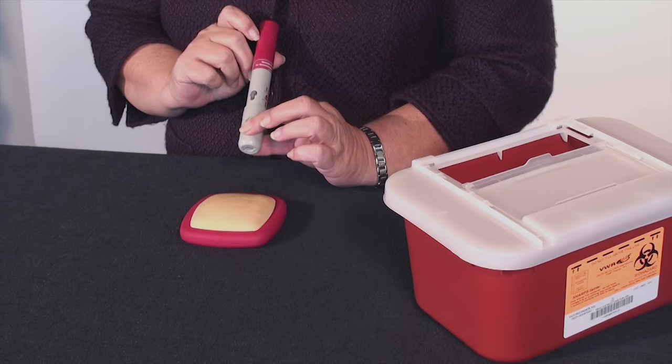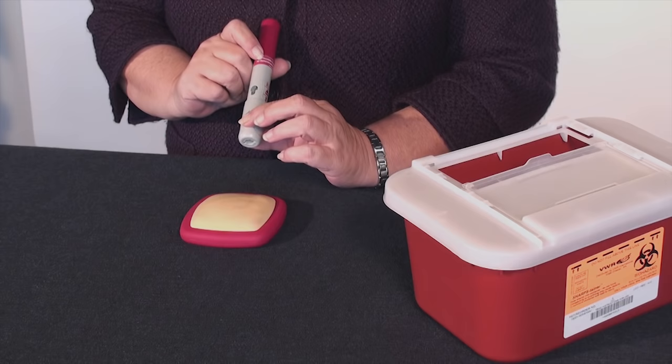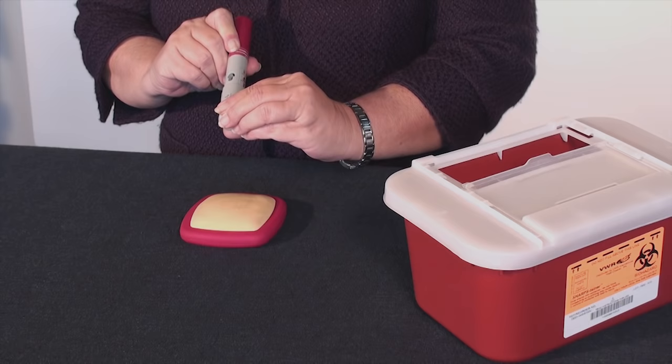Now you're going to take a look at your syringe. You have a cap number one, a cap number two, and a little window. We're going to watch this little window for a yellow indicator once we inject our syringe.